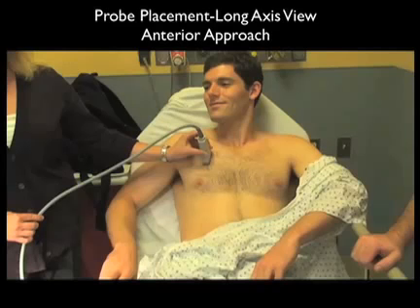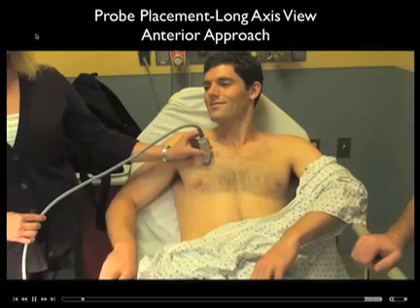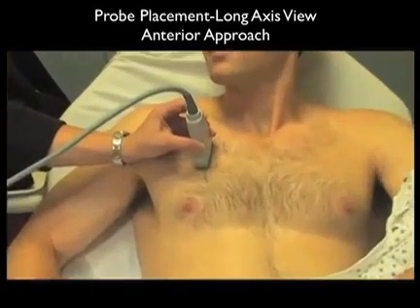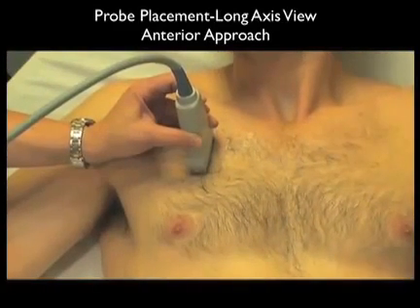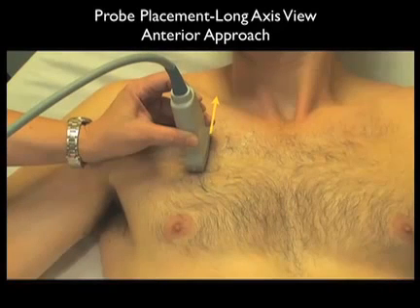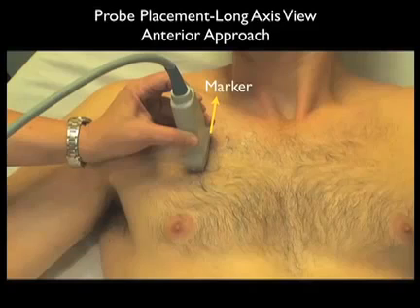Now let's learn how to perform the ultrasound examination for the pneumothorax detection. Here we have the high-frequency linear type array probe positioned on the anterior chest wall at about the mid-clavicular line, looking into about intercostal space 3. Now in most cases of pneumothorax with the patient supine, the air would be predominantly seen in this area.